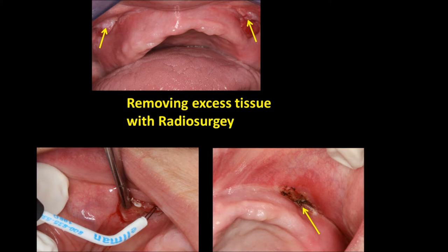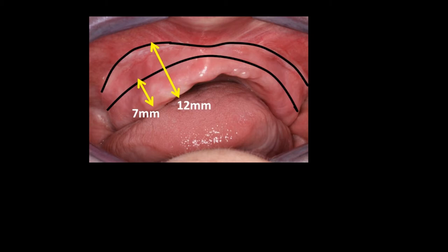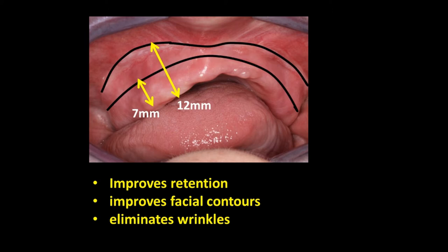We now see the maxillary arch about four weeks after surgery, and the arrows point to redundant tissue. This is where radiosurgery is at its best. You can see one of the electrode tips on the lower left, and on the lower right you can see how the tissue has been obliterated — please note there is absolutely no bleeding. Healing is now complete, and we can see the white scar mentioned earlier. The original vestibular depth was seven millimeters, but we've increased this by five millimeters, so the new vestibular depth is 12 millimeters.